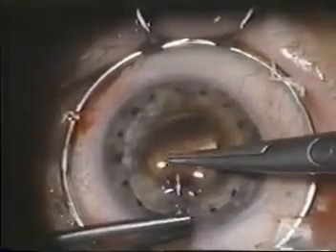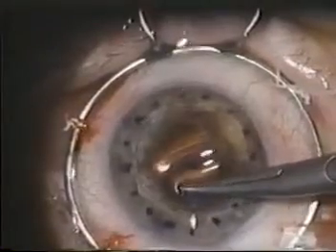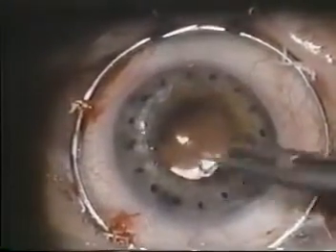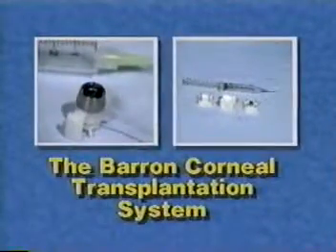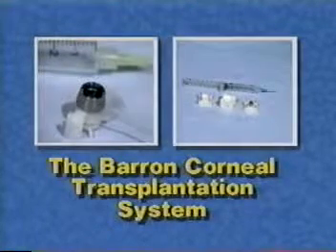Today, the goal of a surgeon transplanting a cornea goes beyond simply making a clear graft. Successful surgery should result in a clear graft with no astigmatism. To accomplish this, the surgeon must accurately cut both the recipient and donor corneas and make sure sutures are evenly placed. All of this can now be done with precision, using only two disposable instruments.